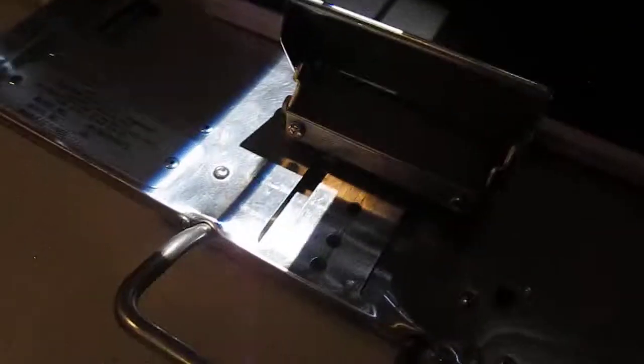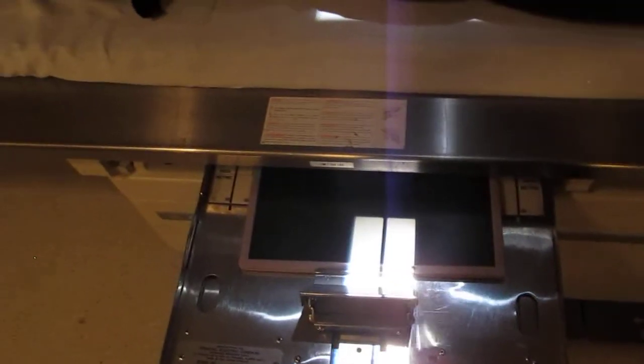So for the first x-ray, which is the AP knee, I'm going to line up the Bucky with an 8x10 or 10x12 grid cassette. I need to line it up. So it's your right knee, sir? Yes. Okay. This is detented. Right knee is right here.